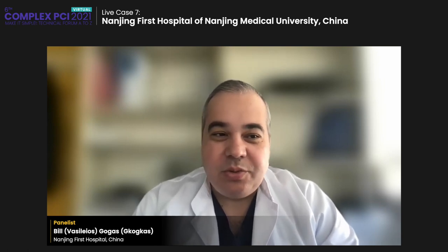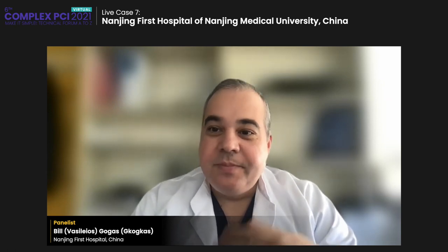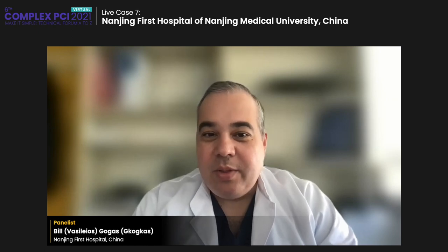So recently we saw the EBC, the European Bifurcation Club. I think the Europeans would prefer a one stent technique, a long stent there, and in case of side branch compromise, switch to a two stent technique. But of course, when there is a lot of skill and experience in double kissing crush, this is also based on the data. This is the most relevant technique to have the least TLF rates and also the best clinical outcomes. Now, of course, I'm not sure. Depending on the geography, the DK crush or the mini crush would be the best technique to save time, equipment and US dollars. But I think we can discuss it later after the lecture of Professor Chen.